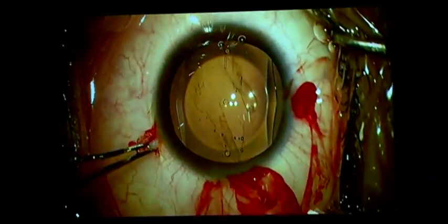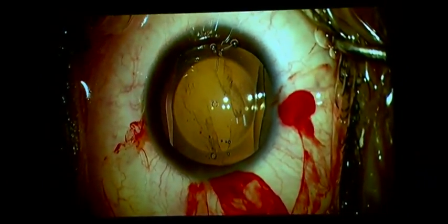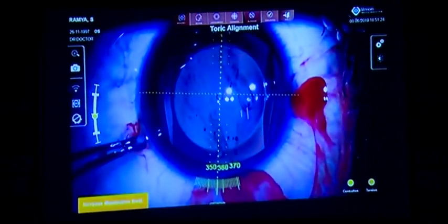Can you show the screen now at this stage? But the screen shows this one only, no? The Varian shows this. No, I'm going to align the Varian now.